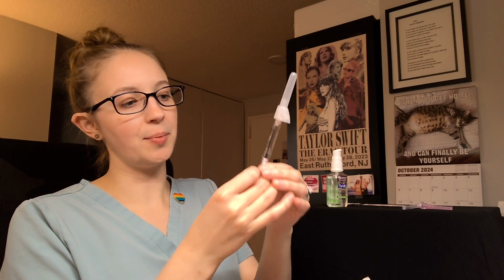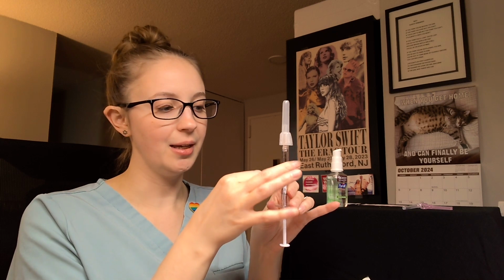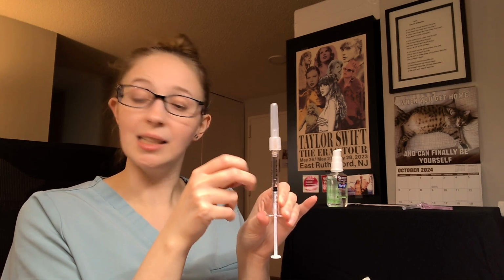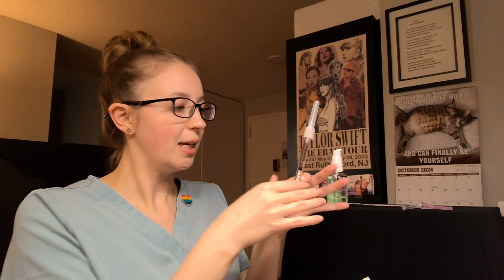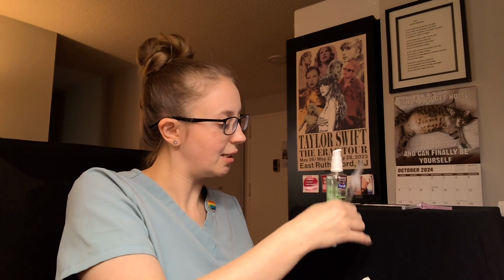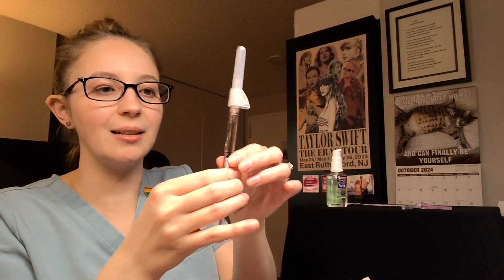Now this can be a tricky part, is we're going to try to get this air bubble out. Right now my air bubble's at the bottom of my syringe. I want it to migrate to the top. So I'm going to flick it really hard. This does hurt your nail if you're doing it right. The other thing you can do, if you're a sissy like me and don't want your nail to hurt, is you can tap it on your table. And that will sometimes jostle it loose enough that your air bubble will get to the top of your syringe, which, voila, mine has successfully done.